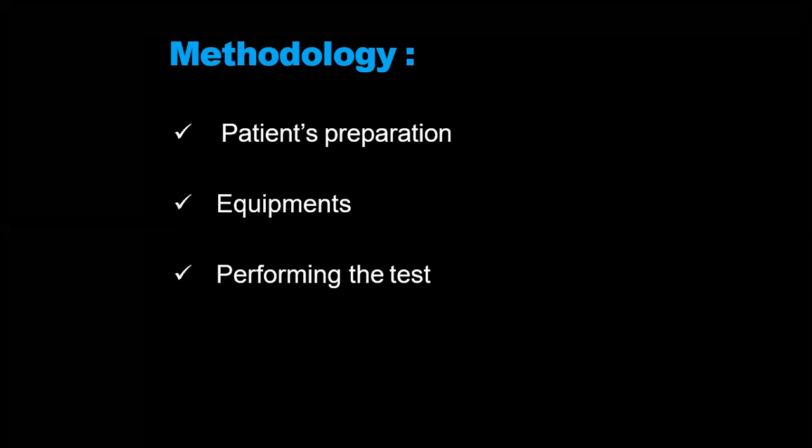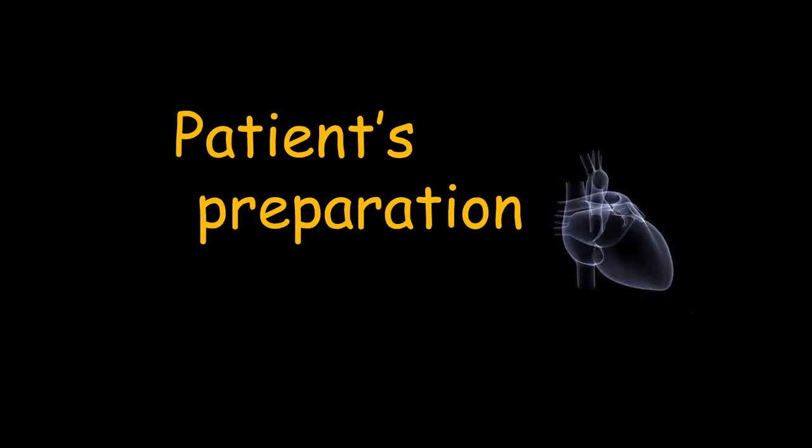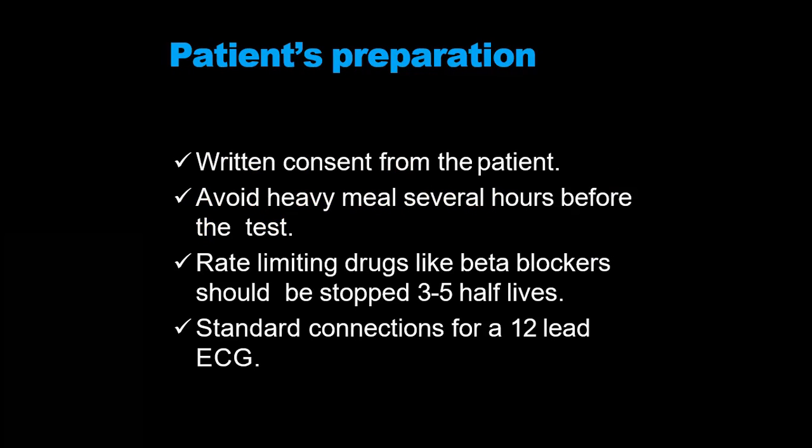What is the methodology? It involves patient's preparation, some equipment, and performing the test. So what is the patient's preparation? Written consent, avoid heavy meal several hours before the test. Rate-limiting drugs like beta blockers should be stopped 3 to 5 half-lives. Standard connections for a 12-lead ECG.